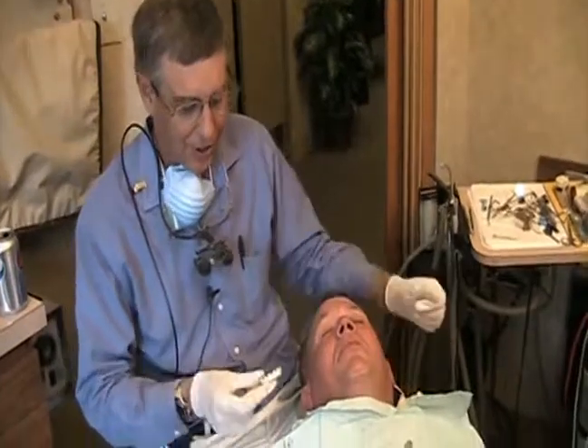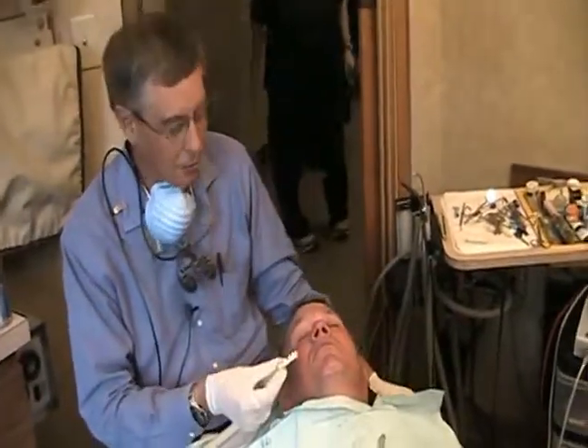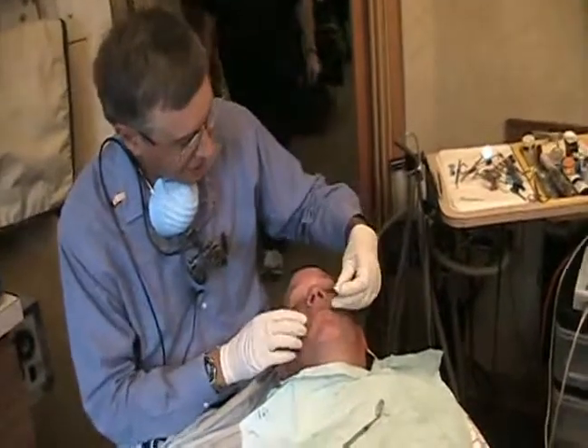So we've made a temporary set of teeth here. This will be a good indication of what we're going to be able to put in on a permanent basis.